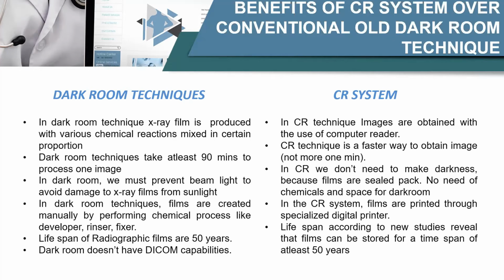Here in CR system, we don't use that. It happens on the computer, so it consumes very less time. Lifespan of both the techniques, after developing image, the image remains for at least 50 years intact. I mean, we can see that image quite clearly after 50 years also.